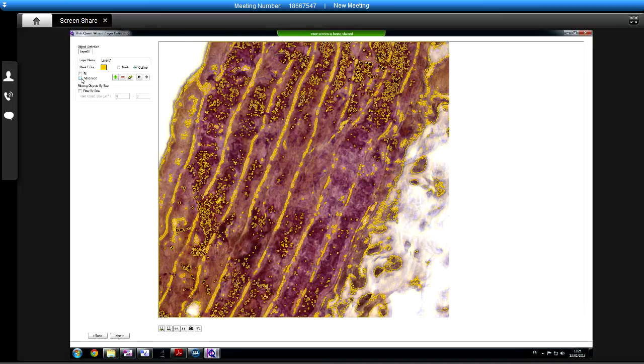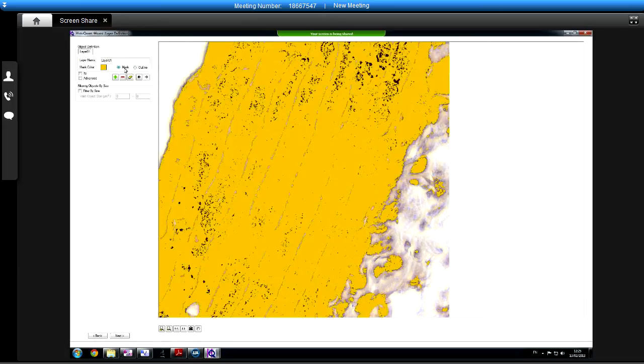How's that? Yeah, that's the right one. Okay. I have a horrible feeling when we was running on the other bit. It's going to go wrong. And I think filtering by size is going to help here, to be honest. Okay, let's just run it on a bigger area and see what we get.